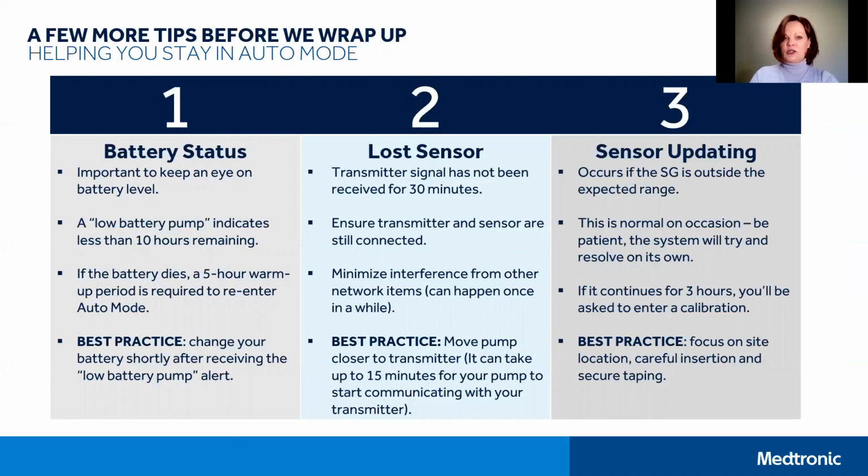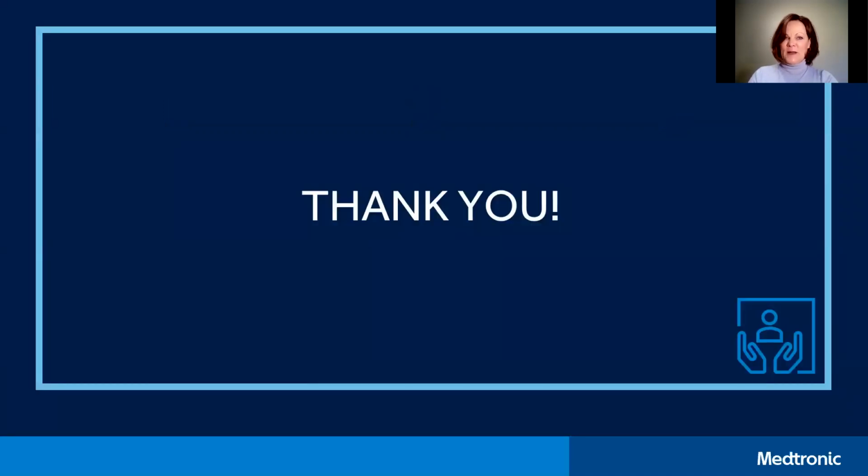It's recommended to ensure that you have a good sensor site location with careful insertion and secure taping to help mitigate receiving this alert. This wraps up our second CGM video focusing on auto mode, and hopefully you found this information helpful.